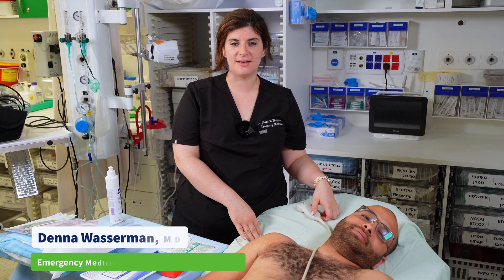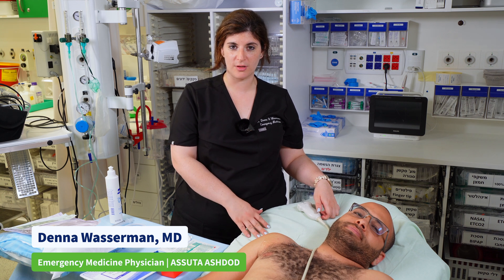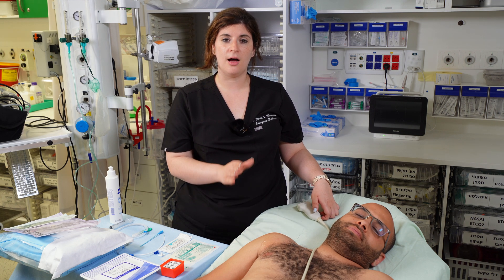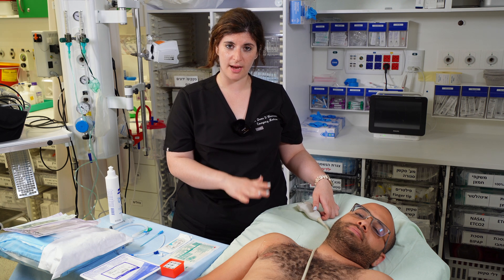Today we're going to go over how to place an ultrasound-guided subclavian central line. This line is preferred because it is cleaner than a femoral central line and more comfortable for the patient than a jugular line. The risks include pneumothorax and bleeding, but under ultrasound guidance you decrease the risk of those complications.